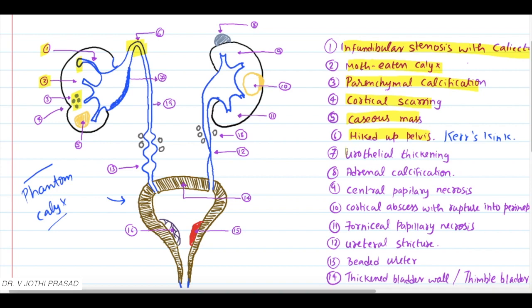Coming to the next finding, which is urothelial thickening. Calcification does not limit to the kidney as well as bladder - it can occur even in the adrenal gland. The eighth finding is adrenal calcification. The ninth one is central papillary necrosis.